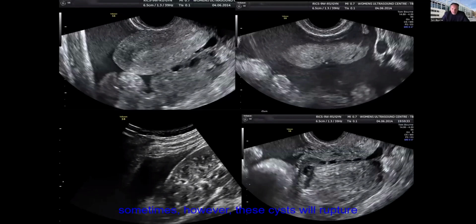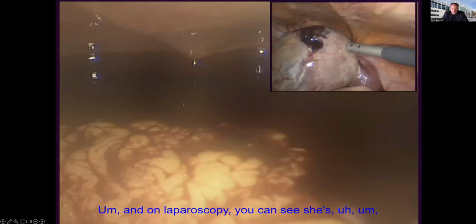Sometimes, however, these cysts will rupture and cause problems, particularly, for example, as this woman did, who is on anticoagulants. You can see the simple physiological cyst rupture. She's got quite a lot of blood here. She's got blood above the fundus of the uterus. She's also got blood in Morrison's pouch. And on laparoscopy, you can see she's certainly got quite a lot of blood present. And here we have where she was bleeding from. It's as simple as that. So on occasion, even with a physiological cyst, you will end up actually having to take action.